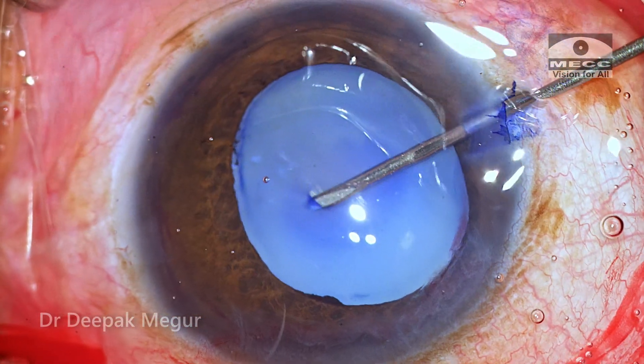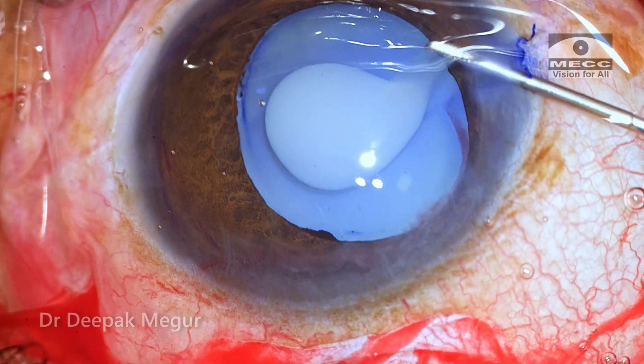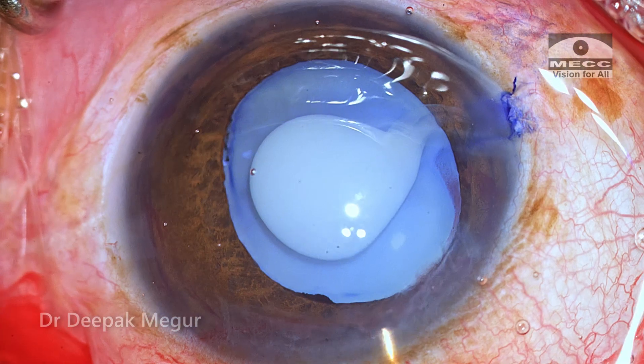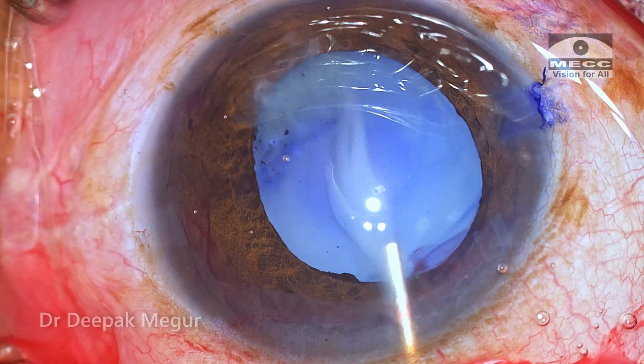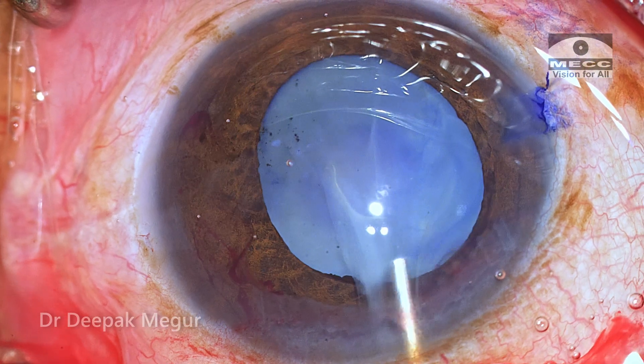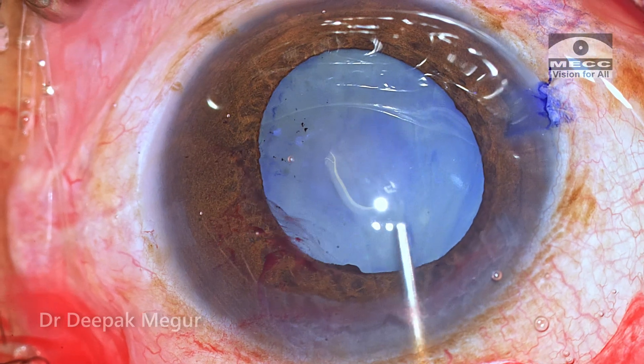As soon as I puncture the anterior capsule, the fluid cortex just flows out as expected. Gentle irrigation with BSS ensures that all the loose cortical fluid which had escaped out is emptied from the bag and also flushed out of the anterior chamber.